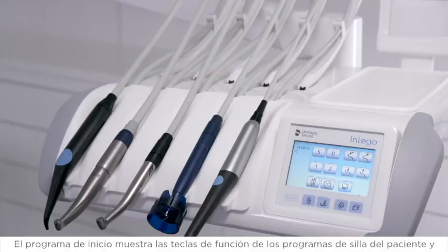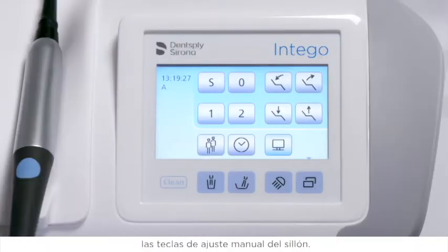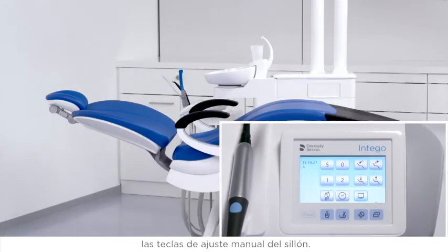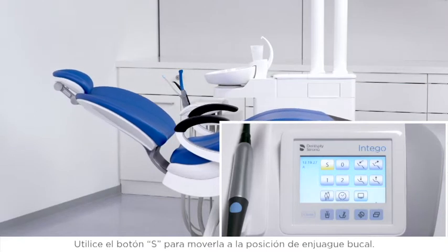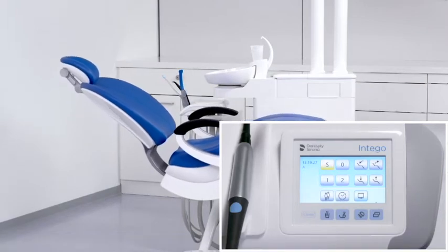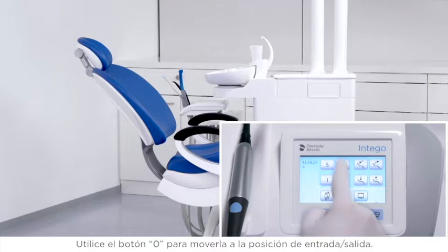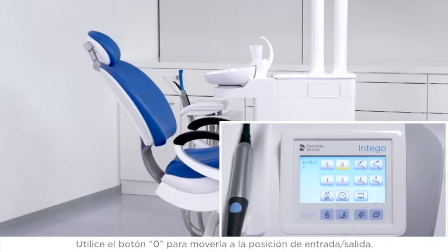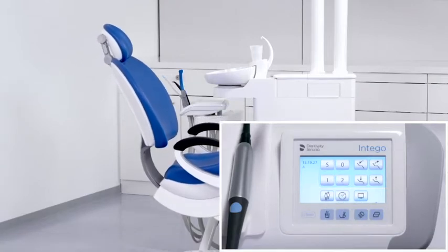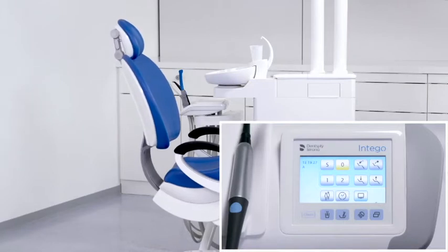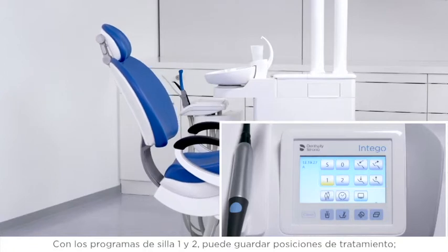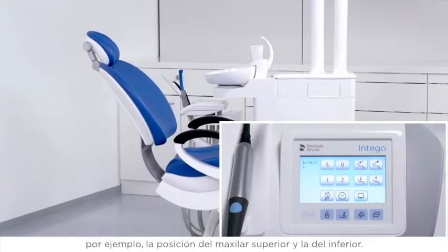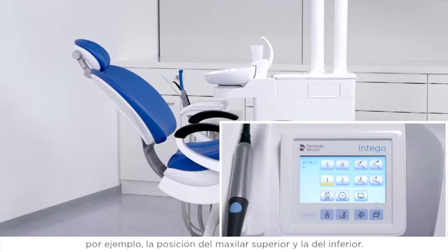Your start program displays the function keys for the patient chair programs and the manual chair adjustment keys. Use the S button to move to the mouth rinsing position. Use the zero button to move to the entry/exit position. With chair programs one and two, you can save treatment positions — for example, an upper jaw and a lower jaw position.